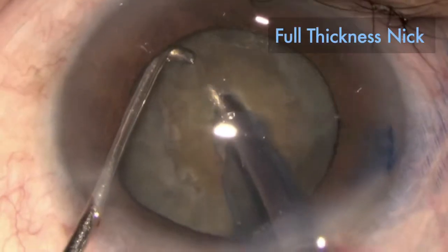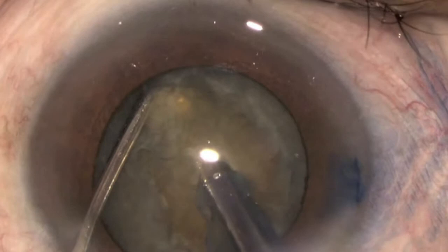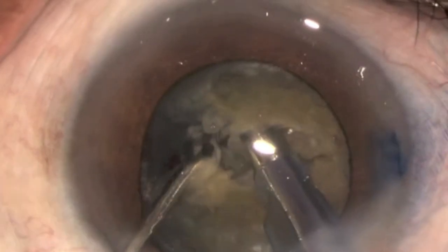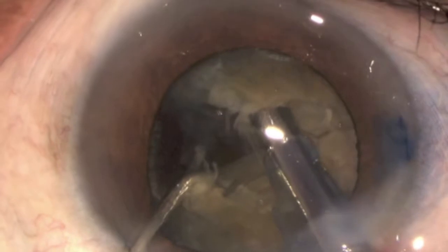Akin to tearing a fabric, in terminal chop a full thickness nick is given at the soft and thin equator of the nucleus with a blunt chopper. Then both the edges of the initial nick are firmly held with both the blunt chopper and the phaco tip, which is already impaled and positioned at the equator.